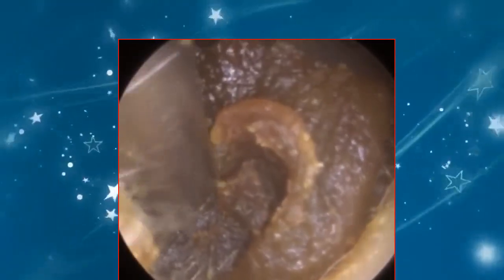You can just see those hairs, and that's the first bend. And the second bend is where the plug of wax is, just to the left. You'll see the ear canal there. So it gives you an idea of the architecture, the curvature of the ear.